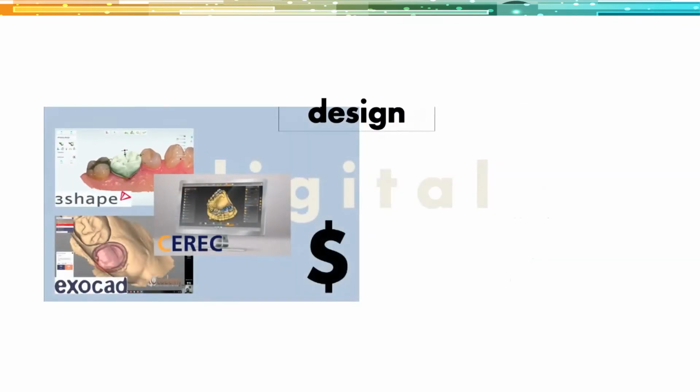And so if you're thinking about getting into design in your dental practice, being a dentist, you have to understand that there are paid softwares and there are free softwares. And so to be able to manage design in your office, you need to have some kind of CAD design software. And these are some of the most common ones that are used today.